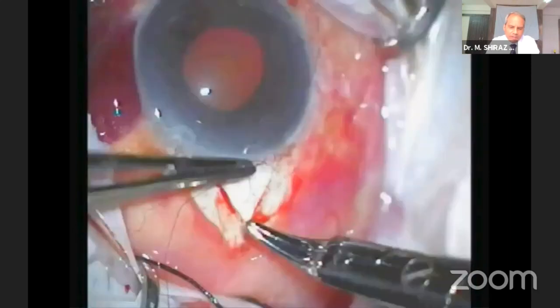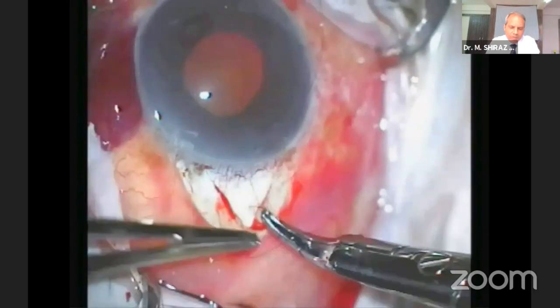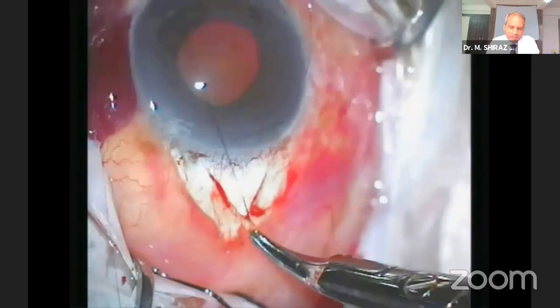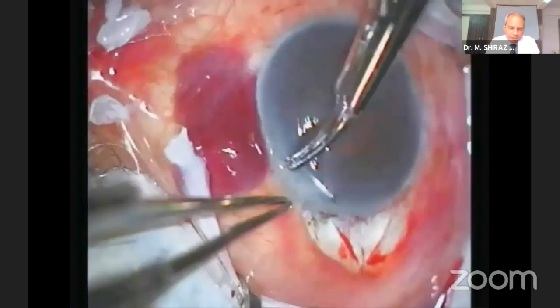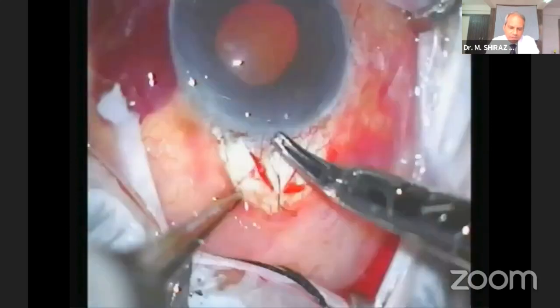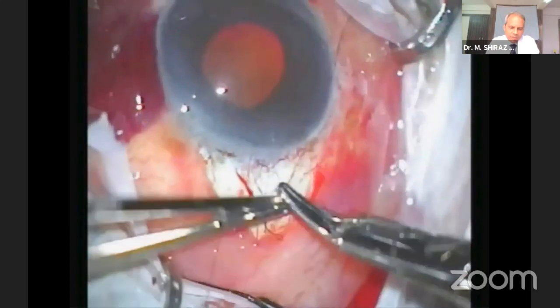The pre-placed regular suture is being applied at the apex of the scleral flap. Having placed the suture, the need for further sutures can be assessed by inflating the eye through the paracentesis and observing the amount of aqueous flow through the flap. Here, a second regular suture is being applied to one side of the triangular flap. This is one of the techniques.